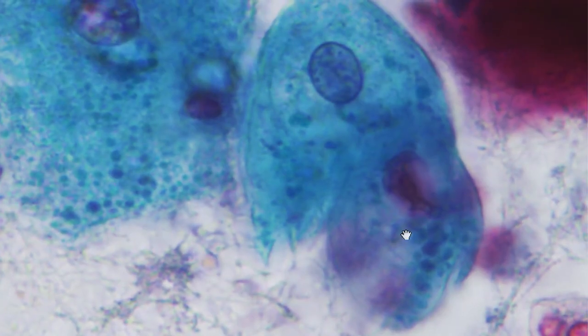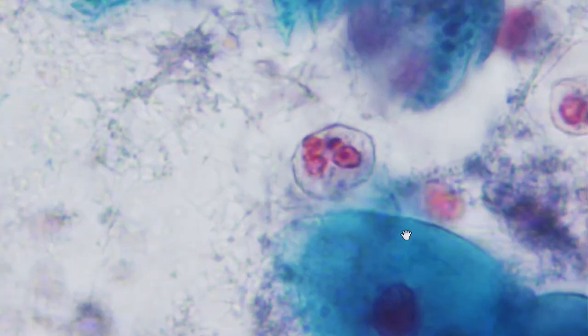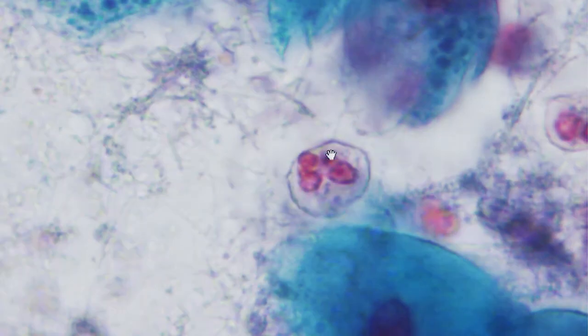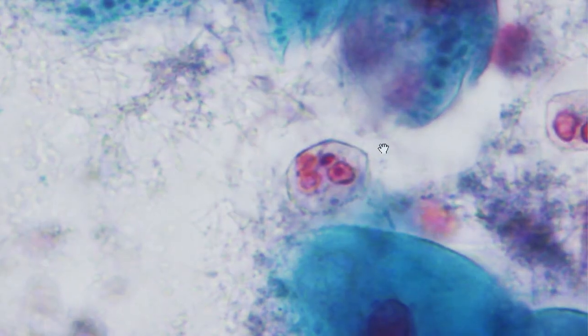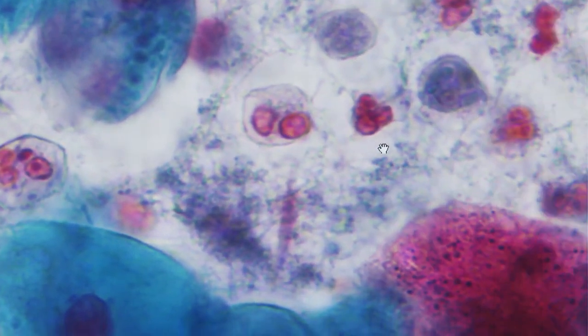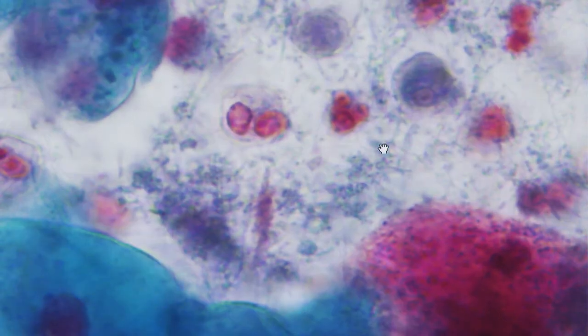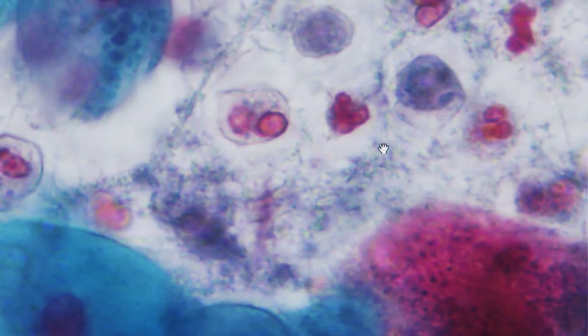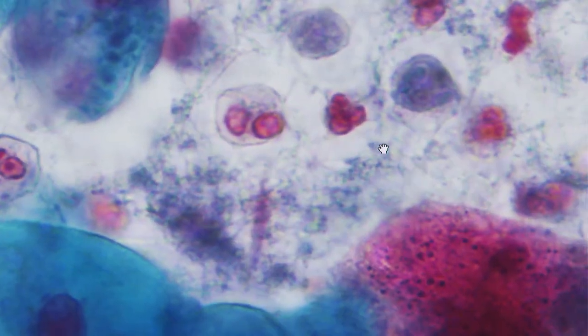Have you ever seen an Entamoeba that looks like that? Well, no, you haven't, because it's not an Entamoeba at all. This is a degenerate white cell. They can be easily mistaken for Entamoebas. You see just how similar the nucleus of degenerate white cells are to Entamoebas there. It's really quite shocking. And it's a trap for new players. I've made mistakes with this early on in my career, calling things like that an Entamoeba, and they're not.